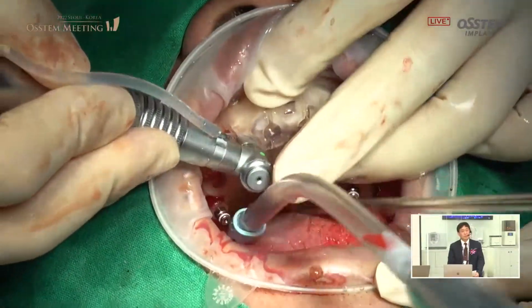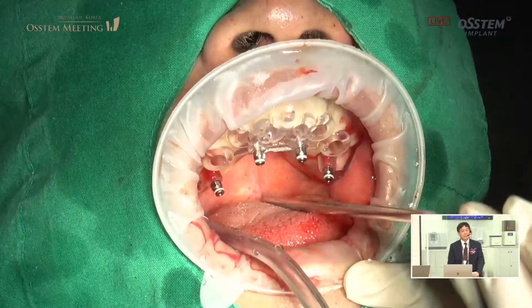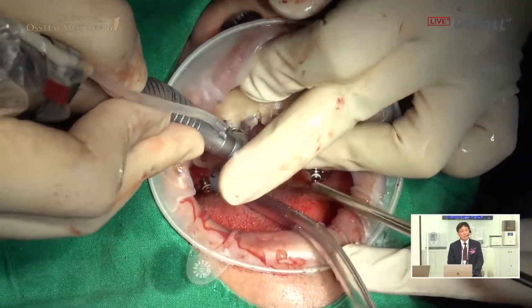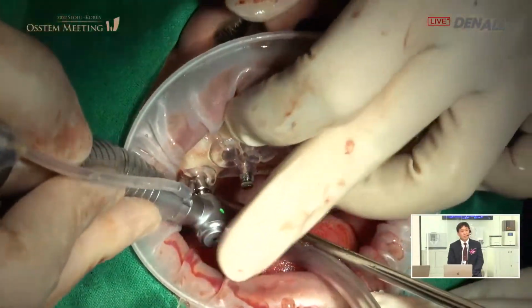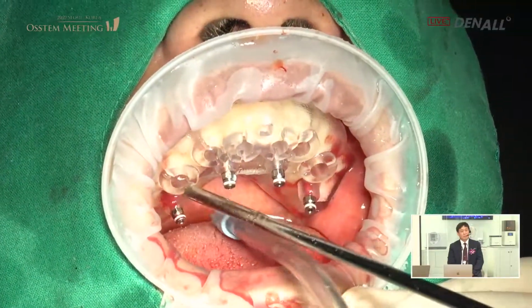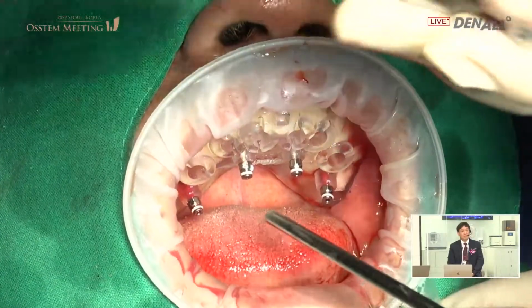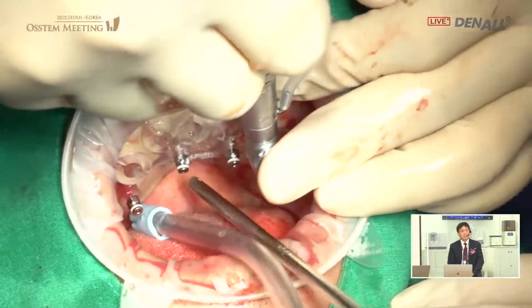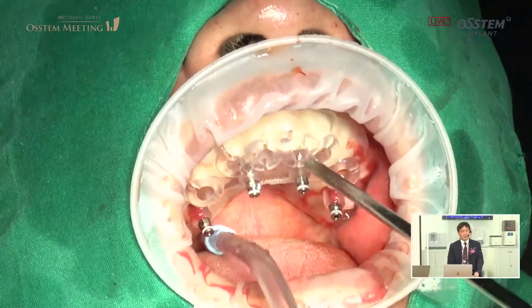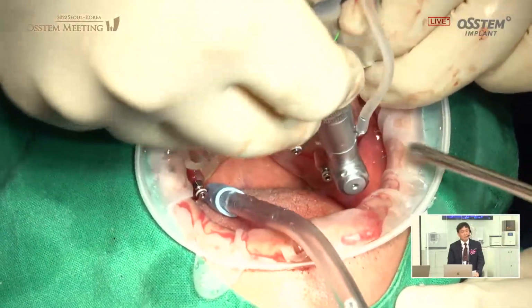As I mentioned during the presentation, for the maxilla, I'm going to use a digital temporary denture. It's going to be used different from the mandible, using a combination. Before live surgery, I'm a fan of Dr. Jung-in Bae, and I listened to his presentation carefully.